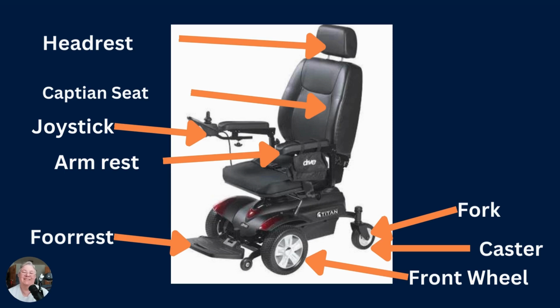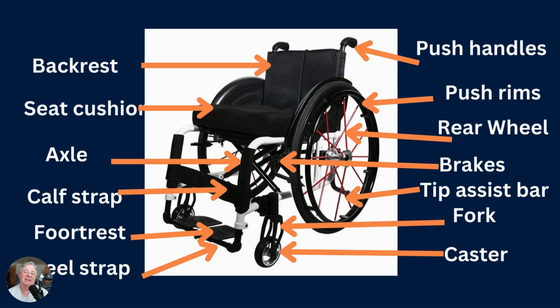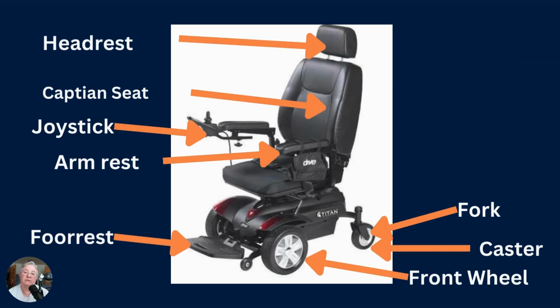So yeah, feel free to pull up this presentation again, to learn your parts. If you forget them, the presentation is there, and this one is a tricky one to do. There are a lot more parts in the manual wheelchair, and there are a lot more parts in the power wheelchair, but for this time, I just wanted to do the basics and make sure it's available to help you.